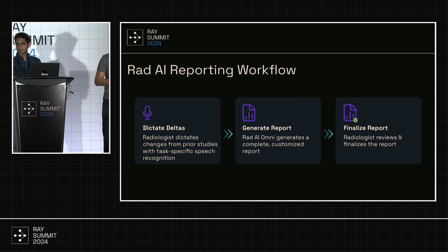There are services that do it for different specialties, like medical transcription. They don't do word for word, but convert it into very specialty-specific things. We can discuss this offline. Yes, we'll talk offline. There are a lot of tools to go from voice to text, but for radiology specifically, I don't think there are any tools in the market that go from bullet points to the full radiology report. That currently doesn't exist in the market.